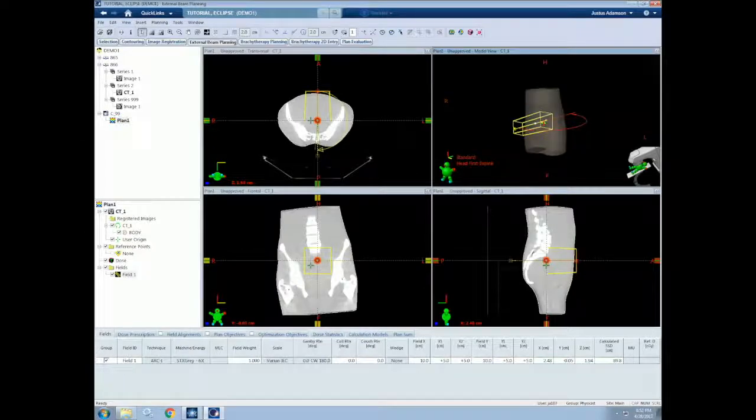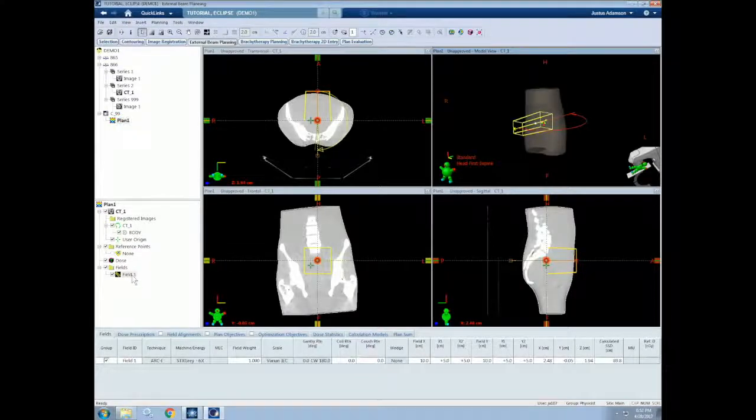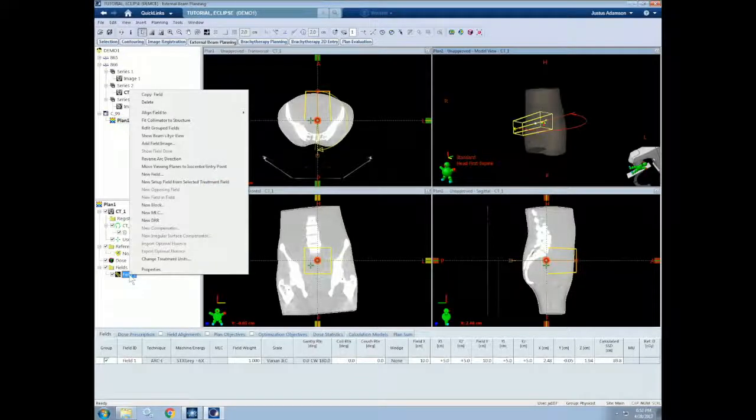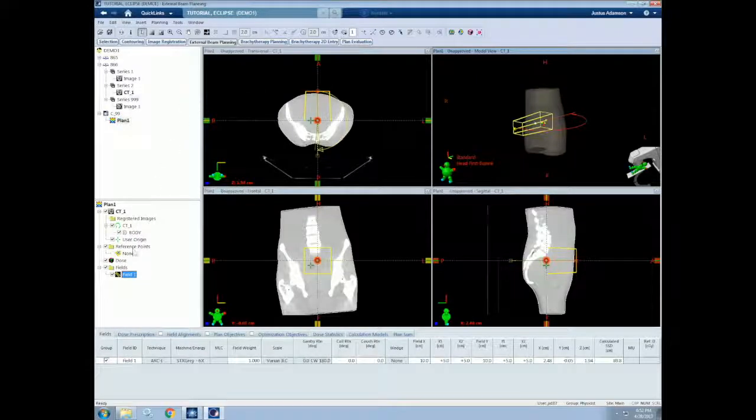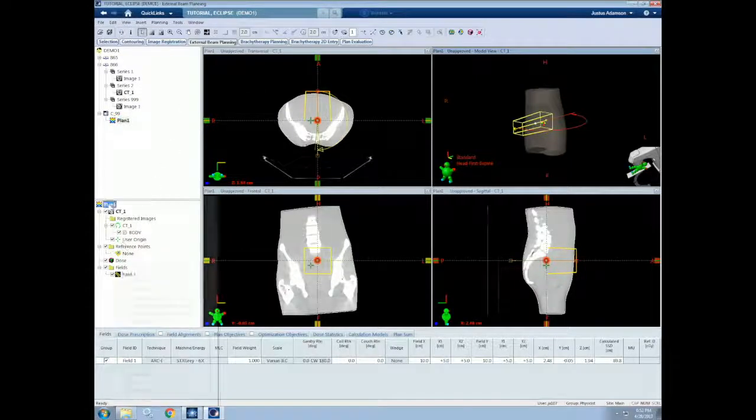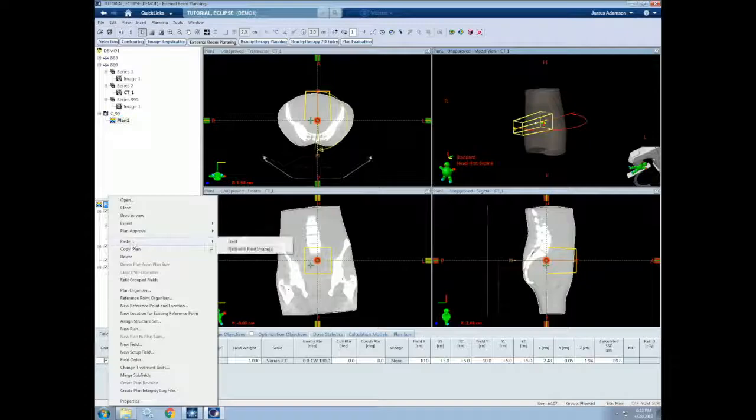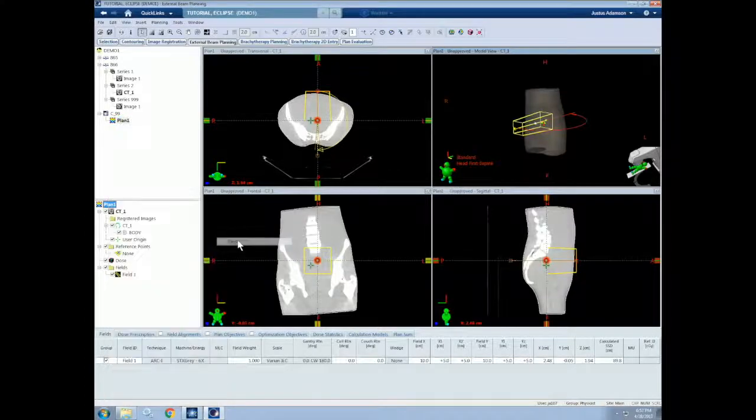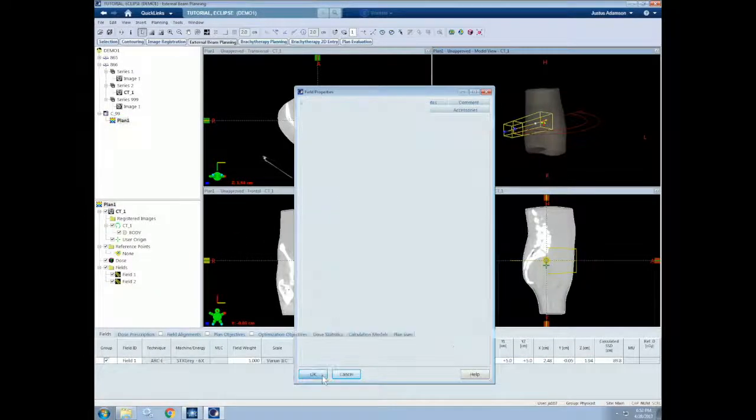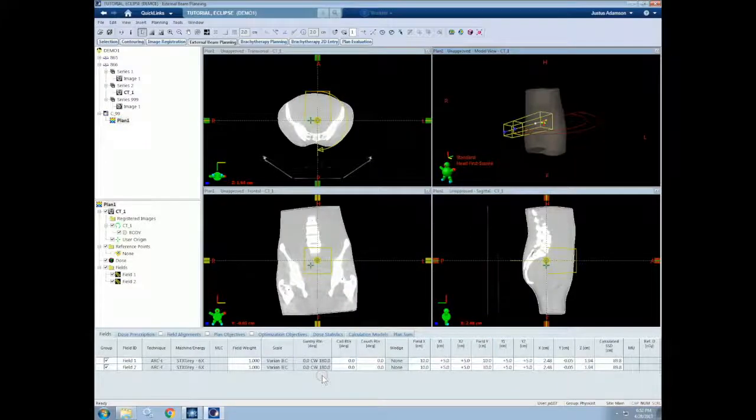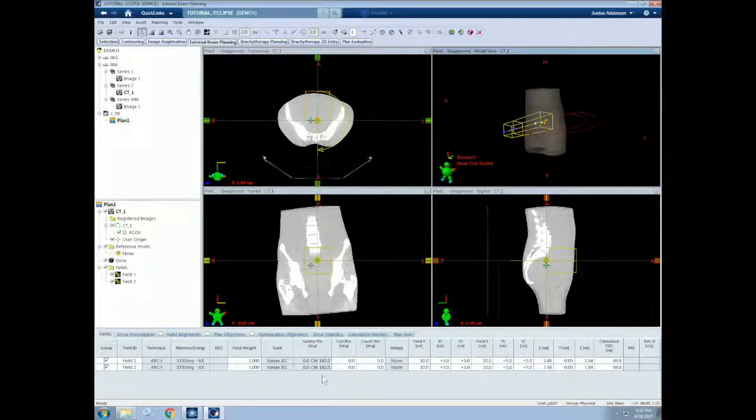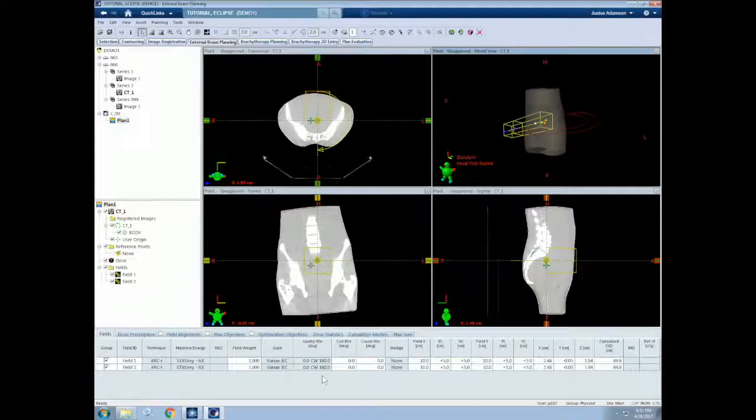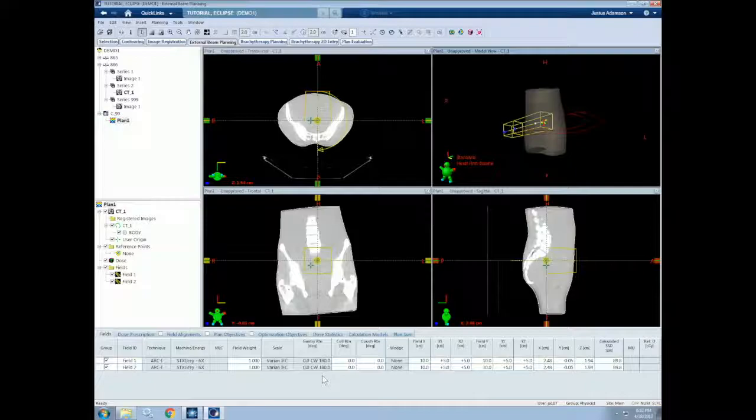One nice feature about fields is that we can copy and paste them to mimic the parameters of an already existing field. So we can either right click and select copy field, or simply do control C, and then right click and do paste field, or control V. This can help increase your planning efficiency. There are also many other things you can do with fields to increase the quality of your plans, as well as tricks that can help you plan faster and more efficiently. You will see me use many of these in future videos, and you will discover many features as you get more experienced.